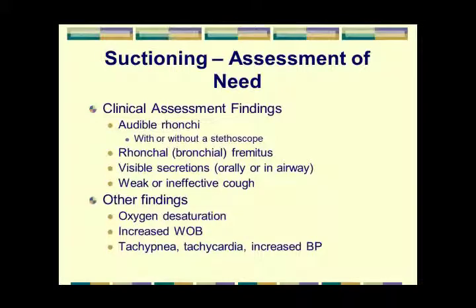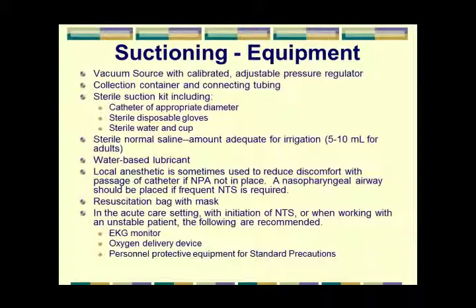And obviously, any of those patients who have a weak or ineffective cough are ones that need to have that process done. Clinically, they're going to look like they're struggling to breathe, being tachypneic, tachycardic, and certainly their SpO2 level will be reduced. So those are the clinical signs that indicate you need to suction.